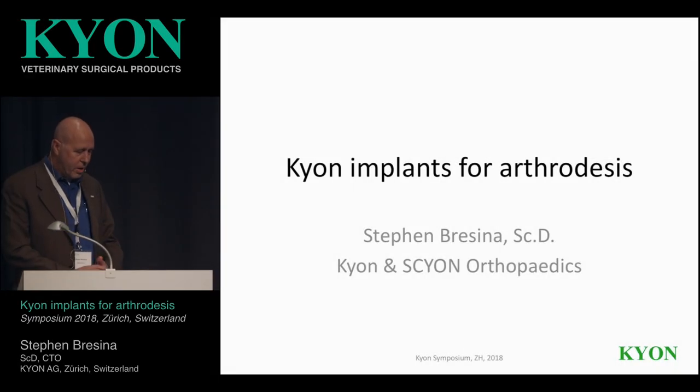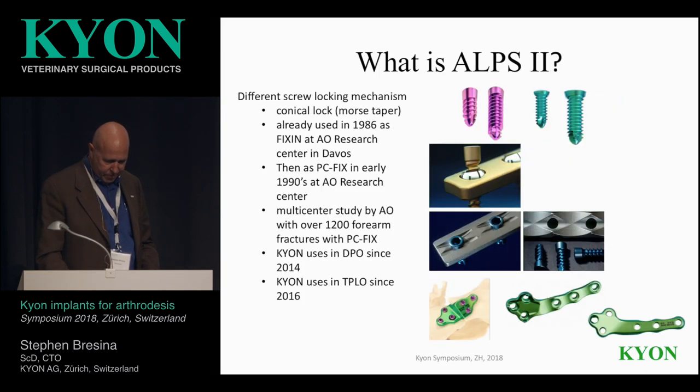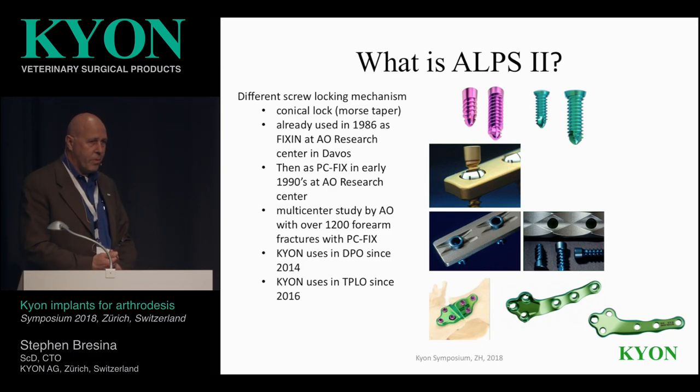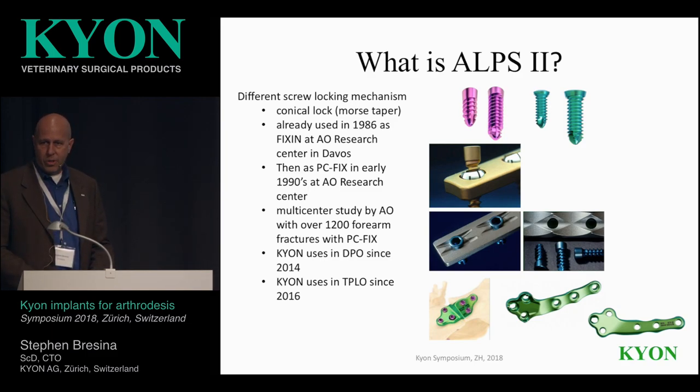This is about the implants that KYON has now for arthrodesis. This evolved because of a couple of events. First is that with the elbow system, we knew we had to have some sort of a backup in case there was a failure of the implant, because it's not as easy as if there's a failure of a hip, where you could do a FHO and you kind of get out of the situation pretty easily. What do you do if the elbow implant fails? So we knew we had to come up with an arthrodesis plate.